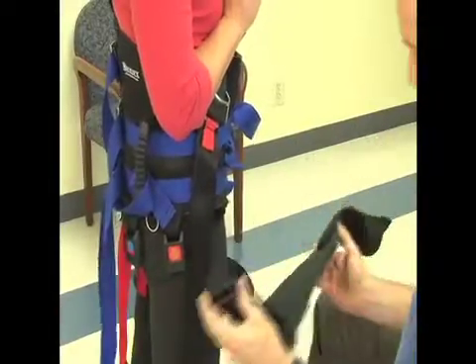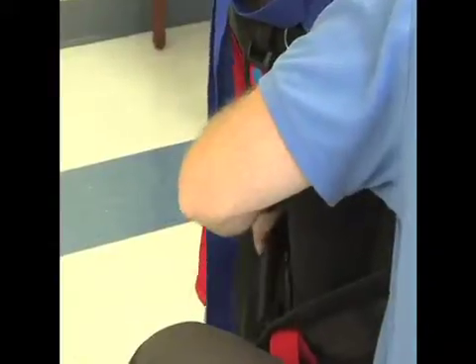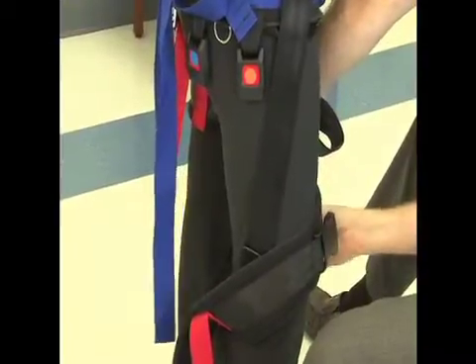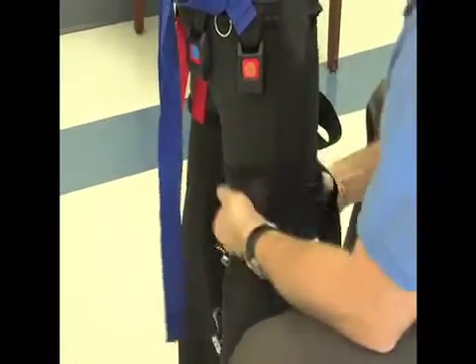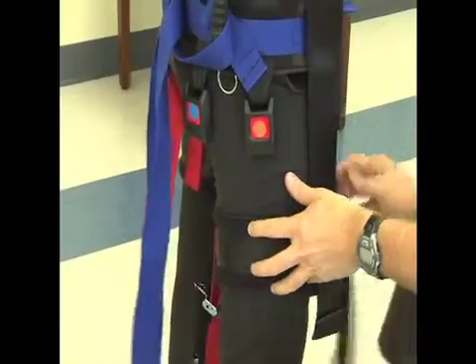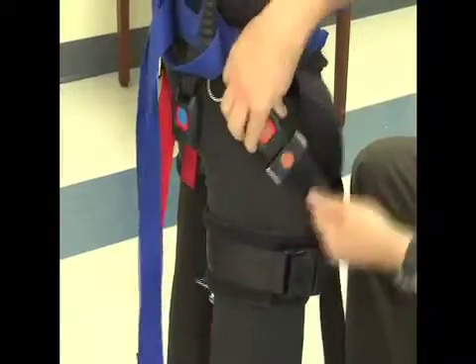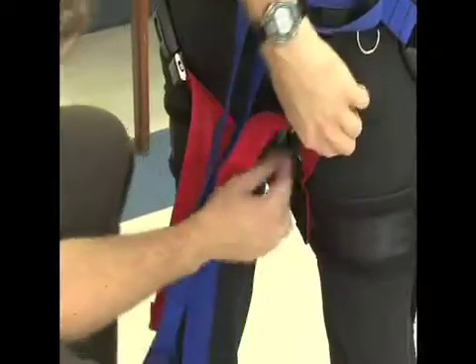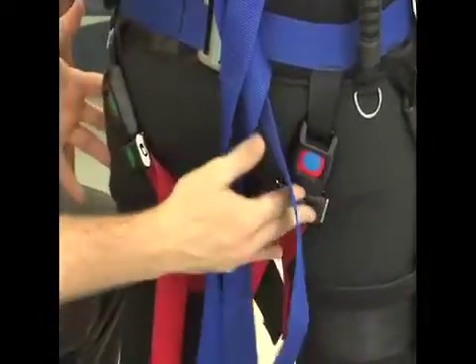Now time for the right side — the thigh strap. Connecting brown to brown, coming around the backside for the gluteal fold, diagonally across the buttocks.